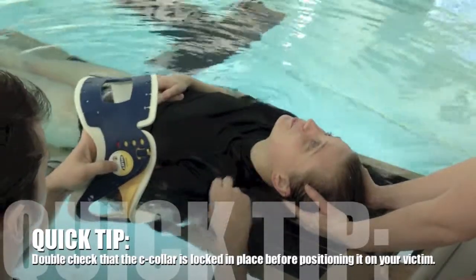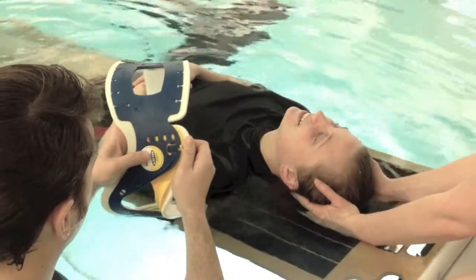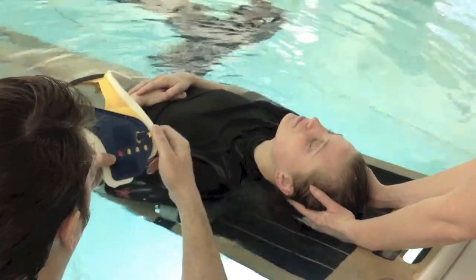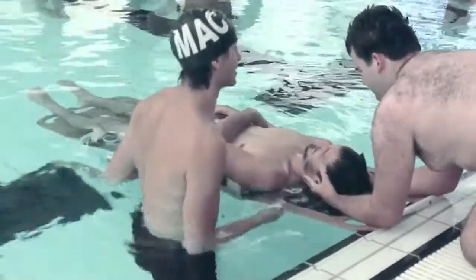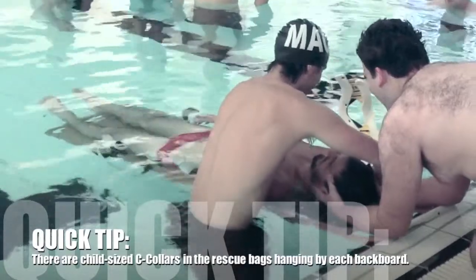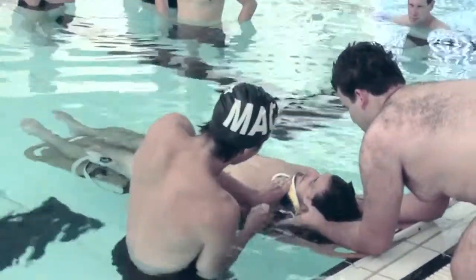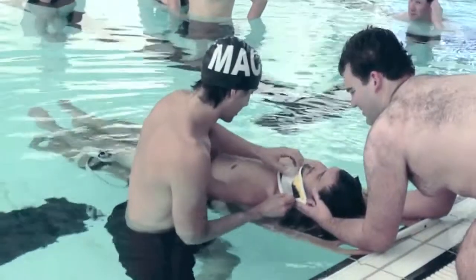To determine the proper size, use your fingers to measure from the top of the victim's shoulder to the bottom of their chin. To assure the C-collar is secure and on correctly, put it on while standing to the victim's left. It may be helpful to put the C-collar on in a U motion. While sliding the flat portion of the collar under the victim's neck, push it at an angle to take advantage of the space between the victim's shoulder blades. Be sure to prevent any movement of the head or neck while you are securing the C-collar in place. The victim's chin should fit snugly into the center of the chin rest to prevent any change in head position.